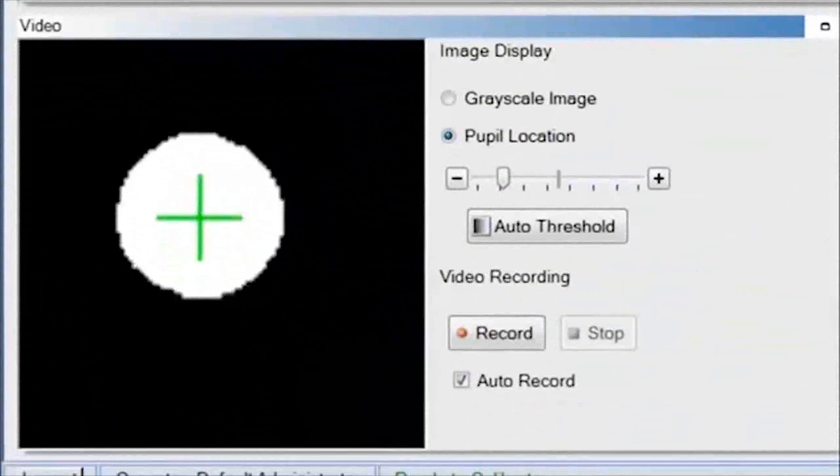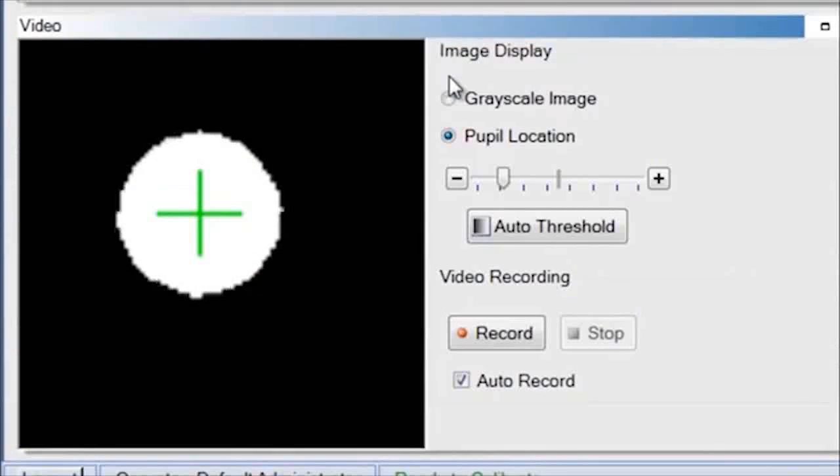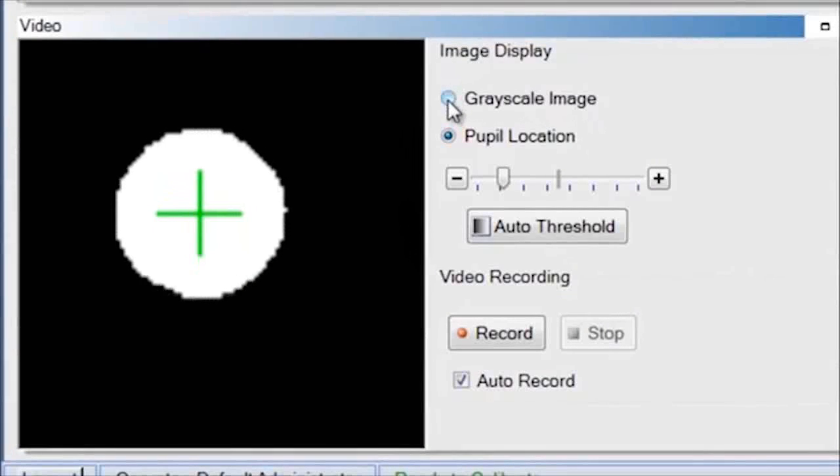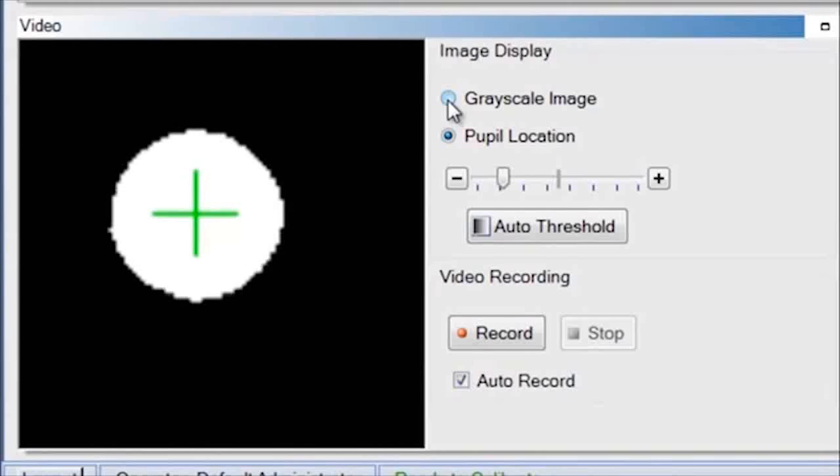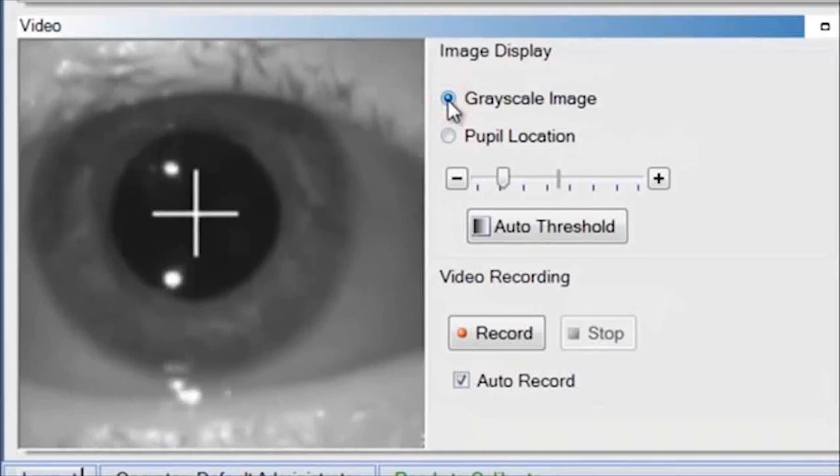You can look at the pupil in one of two ways: grayscale image or pupil location. When it is in pupil location, the pupil is white and the background is black. In grayscale, the white cross signifies the pupil.